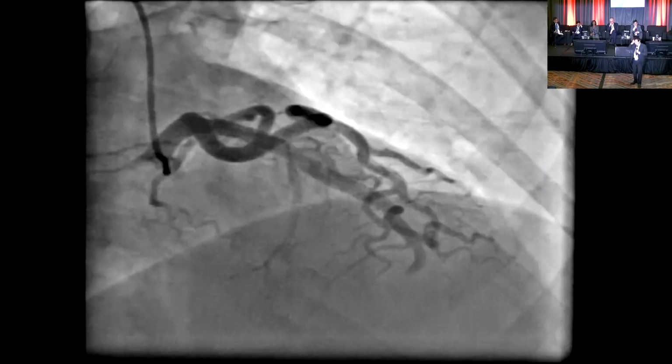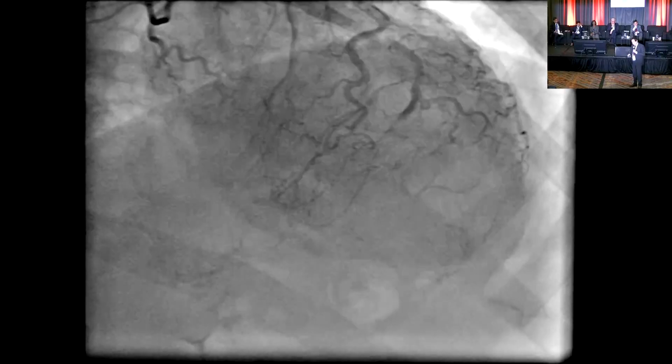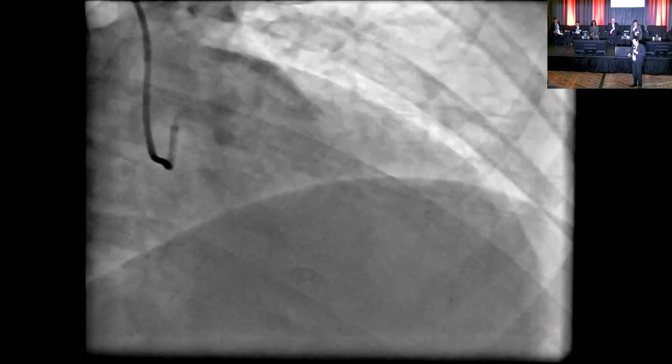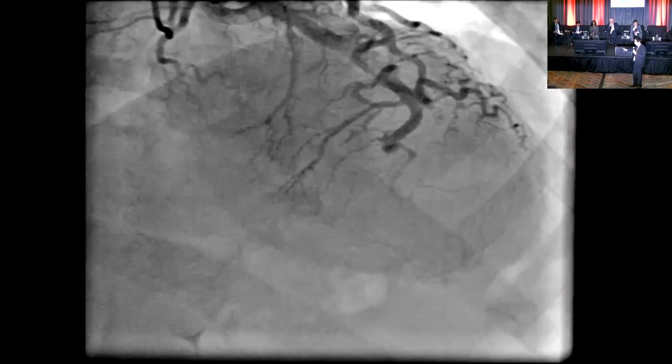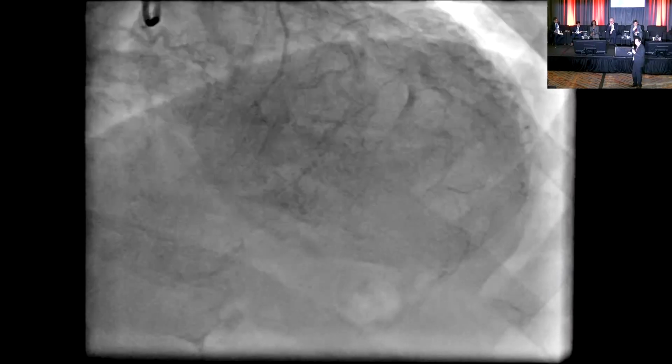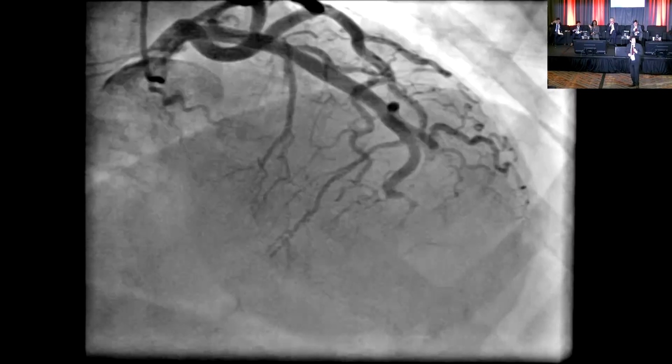This is a young woman who had a VFib arrest and an anterior STEMI on her ECG, and you see an occluded mid to distal LAD. Hands up for, and this is SCAD, I'll give you that. Hands up for managing conservatively. Maybe an audience play here. All right, so the third of people.